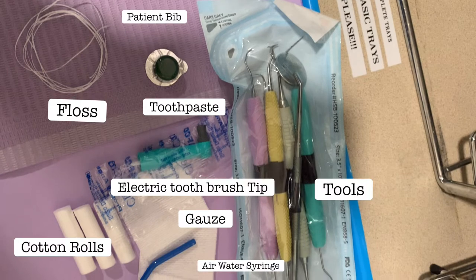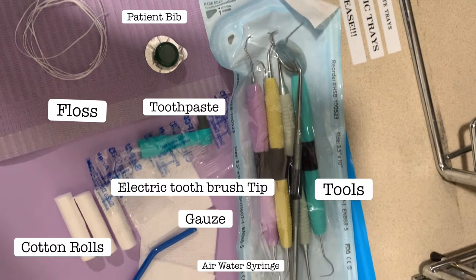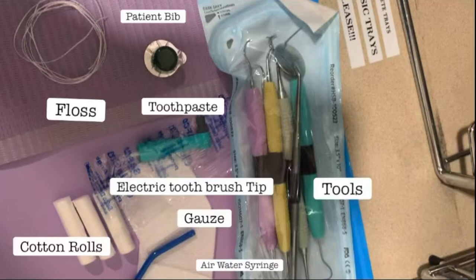I wanted to show you guys what works for me. This is pretty much what the dental hygienist tray looks like — it's different for every dental office. It is very crucial to have everything on the tray; you don't want to have anything missing. Make sure all of the sterilized equipment has all the tools in the sterilized packaging, because some packaging does get messed up or some instruments are thrown away because they're old and have rust or are broken. Keep in mind that all the packaging is correct.